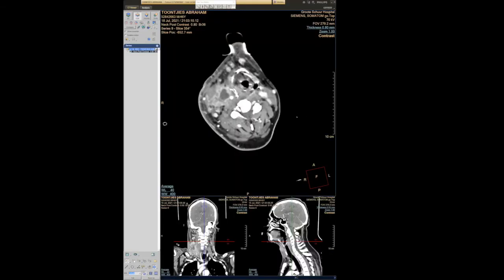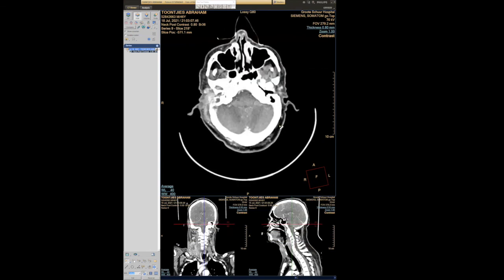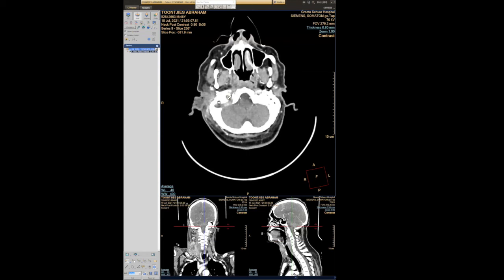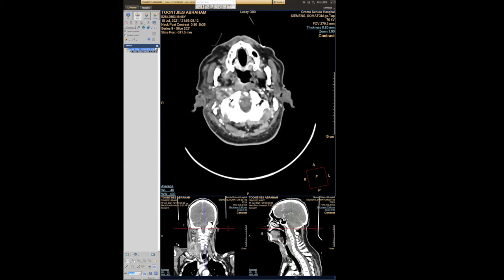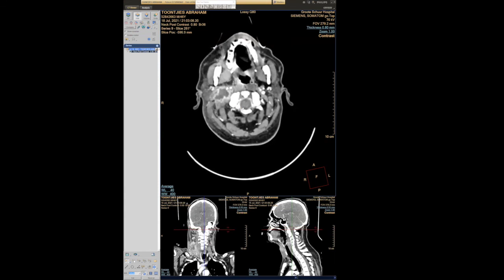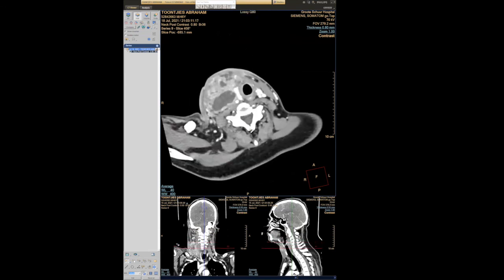So what did you people find regarding the internal jugular vein on that side? The reason I'm asking is if you follow the sinus into the jugular vein there, into the jugular fossa over there, that looks rim enhancing. And then if you follow that out, that's continuous with the rest of this abscess here in the neck, right? So is this internal jugular completely compressed all the way through? That's why I'm asking, what did you find? Because we could only see it right at the bottom, at the base of the neck, coming from the chest.